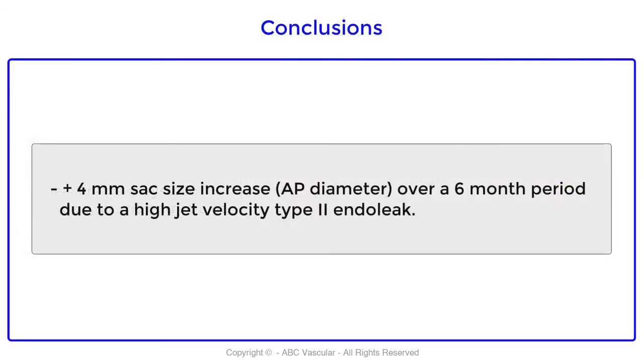In conclusion, we have identified a type 2 high jet velocity endoleak.